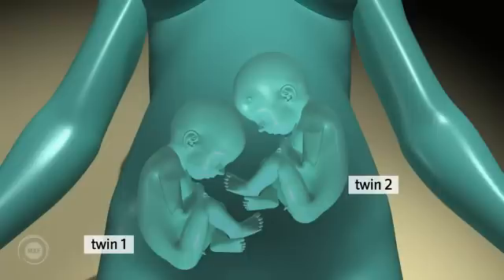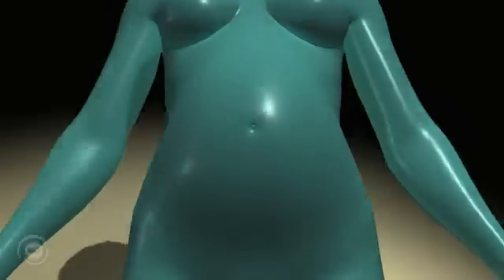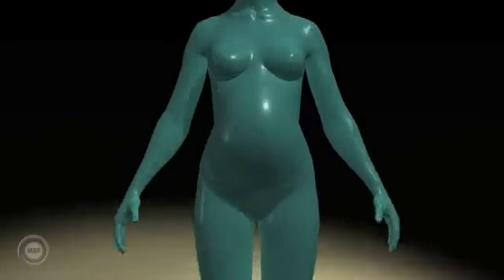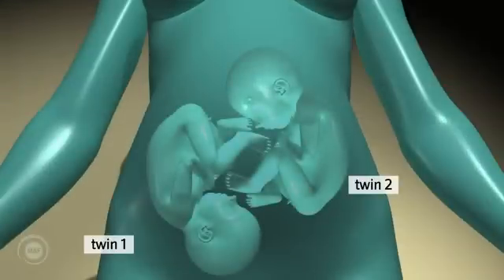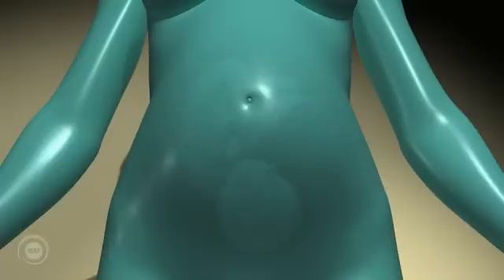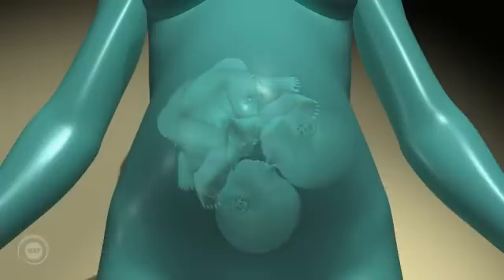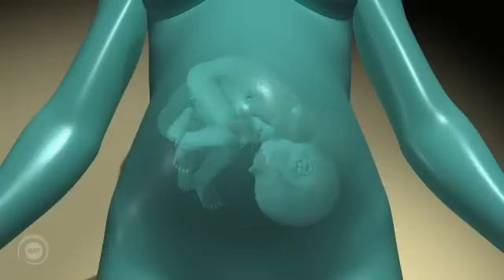Clearly, in some instances twin 1 may be cephalic and twin 2 may be breech. The lie of the twin refers to whether the twin is in the longitudinal, transverse, or oblique position.